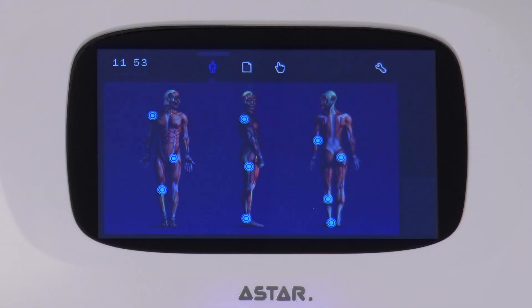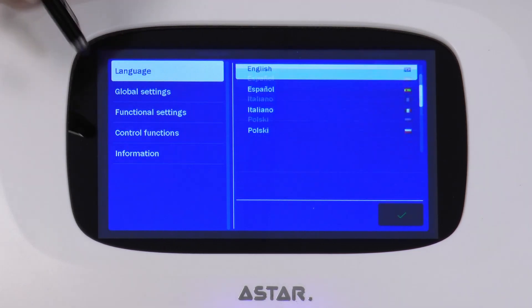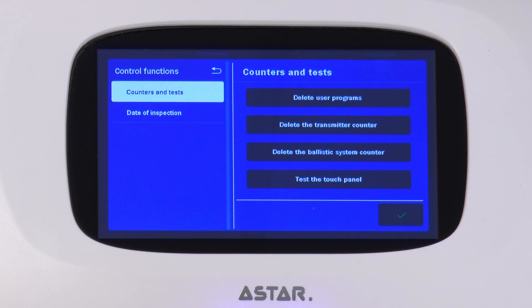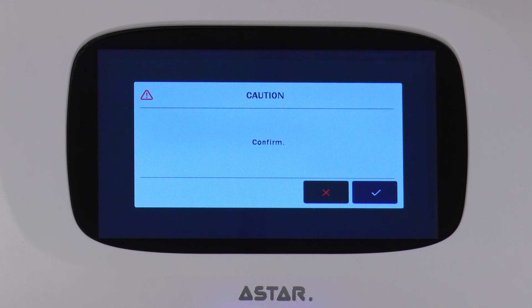Now you may turn on the device, enter the Setup mode, Control functions, Counters and Tests, and choose to reset the ballistic system counter. Confirm deletion with the OK key. Now you can start using the device.